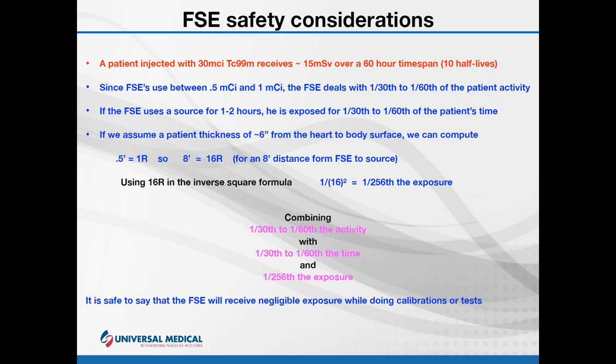We can use the minimal amount of source that we need. You know, if the test says use roughly this much, and I get twice that much, so I have to move my source further away, well, I'm creating more exposure for myself. Use the minimal amount of source that you need. We need to control our distance from the source, the inverse square law, right?